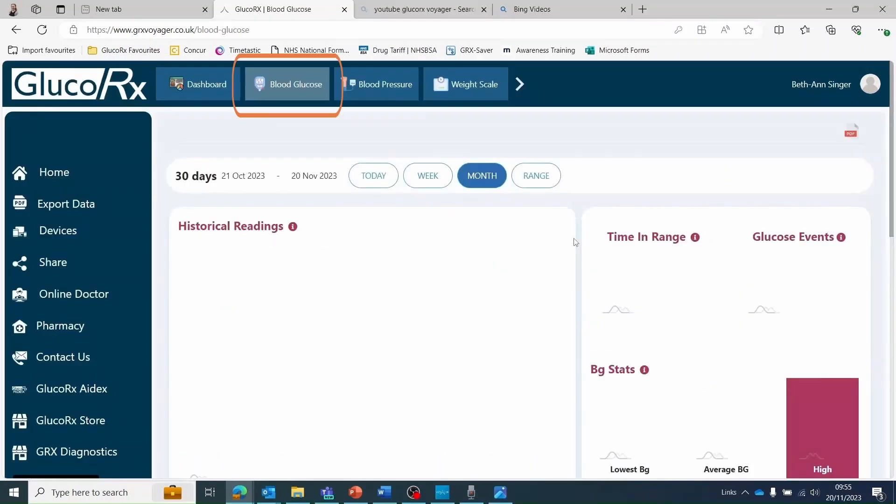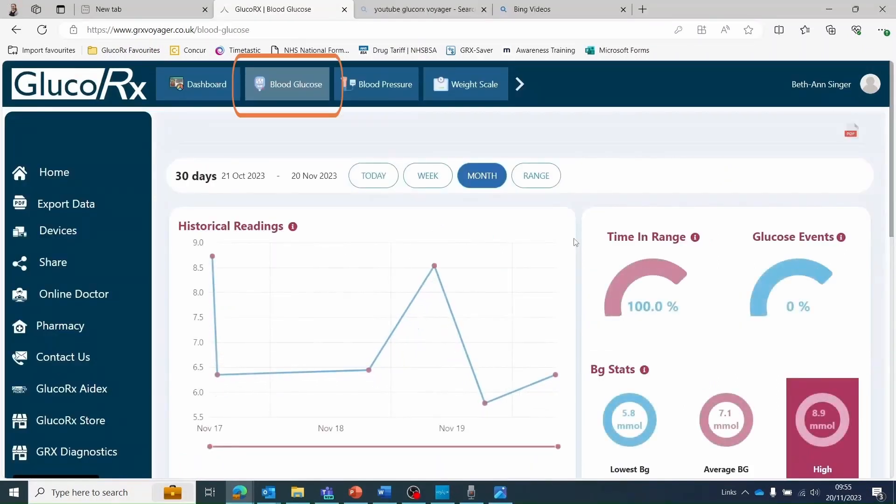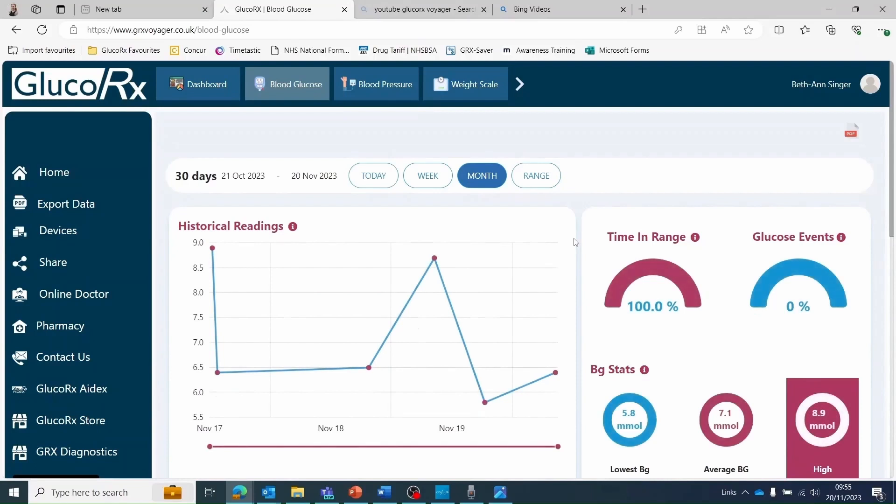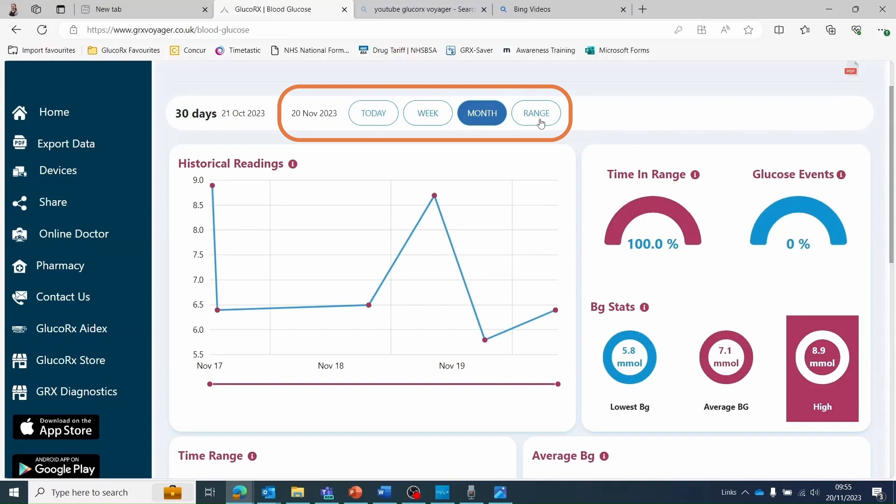Select the blood glucose tab on the top toolbar to view your blood glucose readings in more detail. This page provides a variety of different ways to view or analyze your blood glucose readings. The date range of visible data can be amended at the beginning of this page.